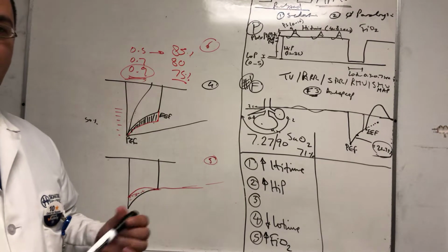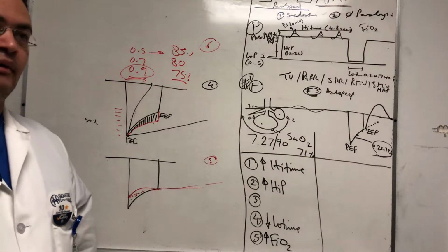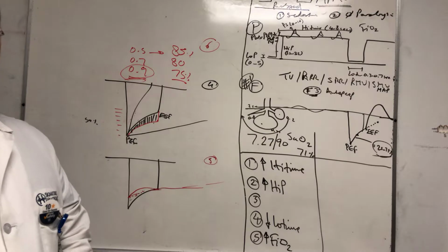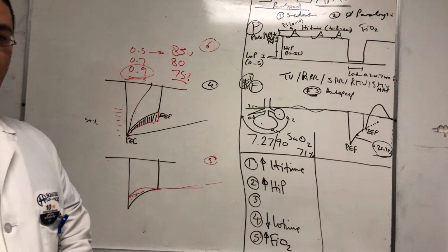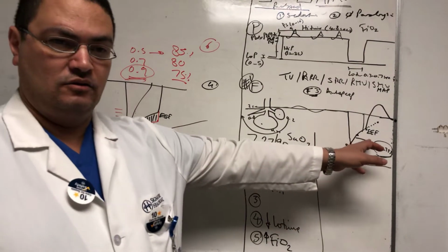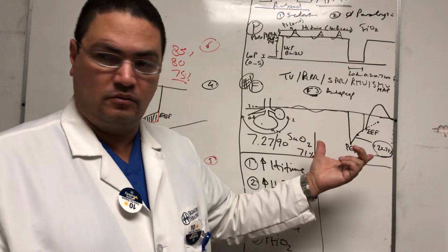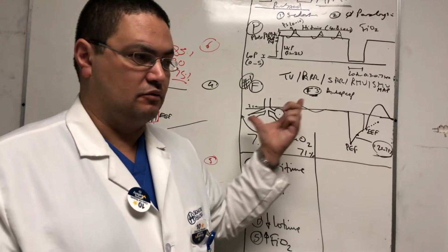So basically, when I use those vents, I just have to calculate and say, okay, how much respiratory rate do we have? Whatever. Then it gives me 6 seconds per breath. More importantly, I want this to be, that's more important, because any small change can result in big problems, right? So I give that first, and whatever is left, I give it for the high time.